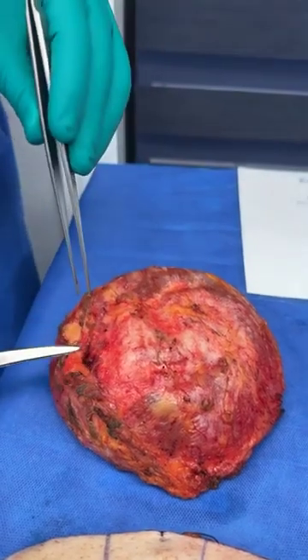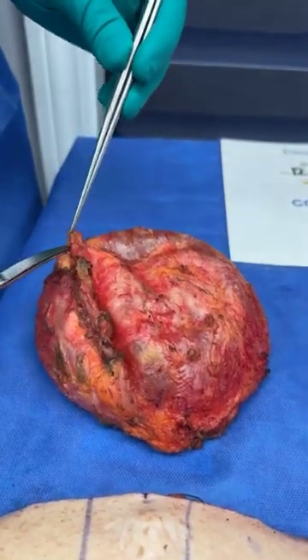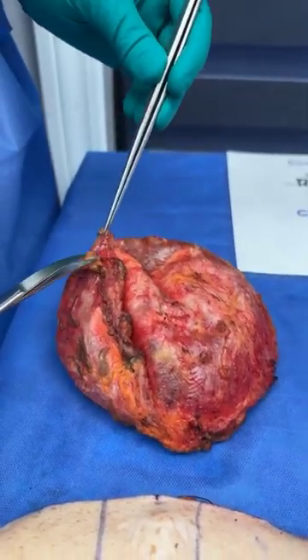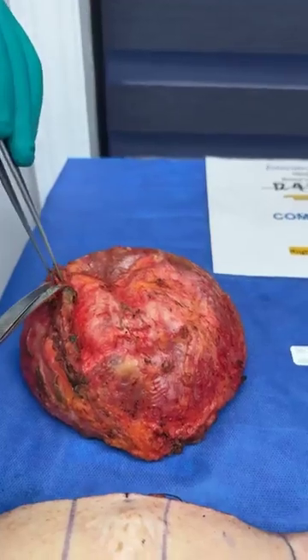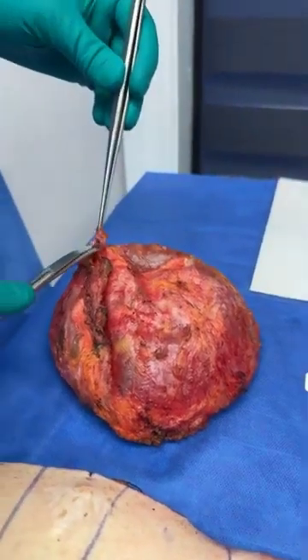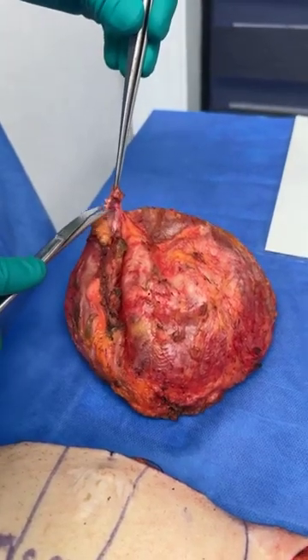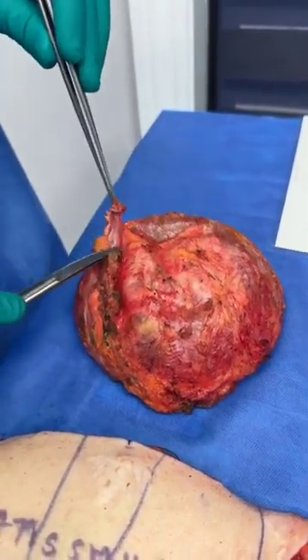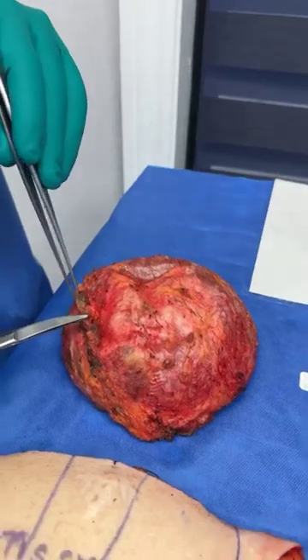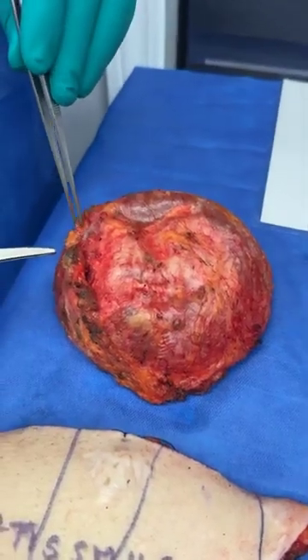Remember, that's part of the process. You can see how it winds around. I'm just going to cut this out so you can see how extensive the Ethibond suture is. And for me, I'm not a big fan of putting, obviously, I don't like to see Ethibond suture in the proximity of the implant. And as you can see, this is suture right here, interwoven, the knots all the way extending from this side to this side. This was actually the superior side.